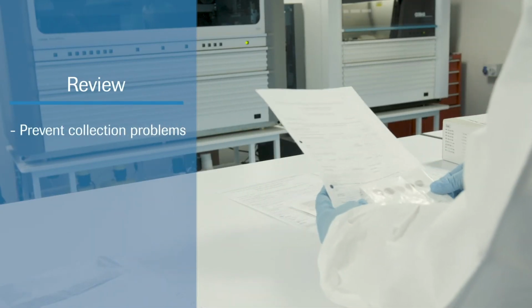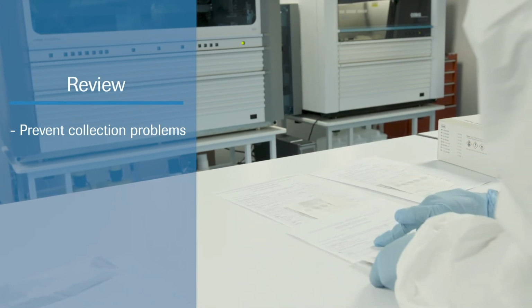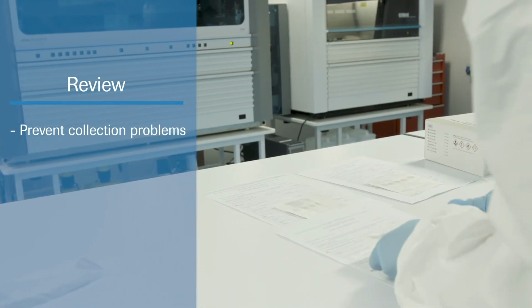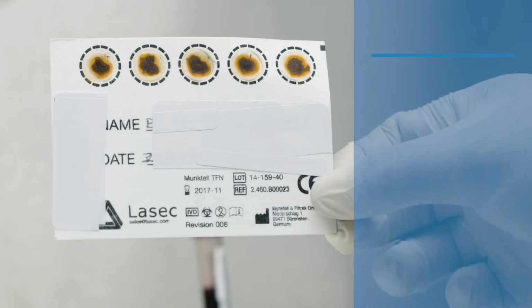Focus on preventing collection problems which can lead to unusable specimens. Here are a few common problems and reminders about how to avoid them, as errors with the sample collection will lead to laboratory rejections and delays in patient care.